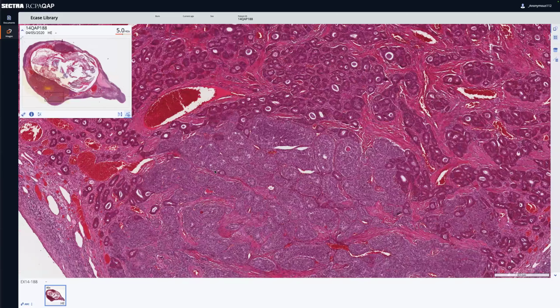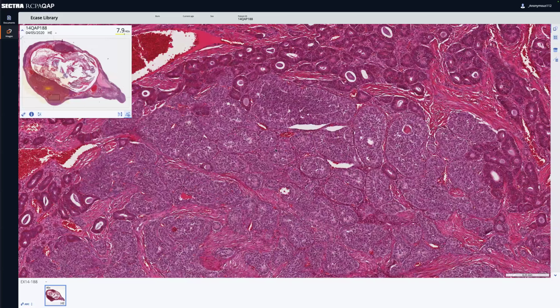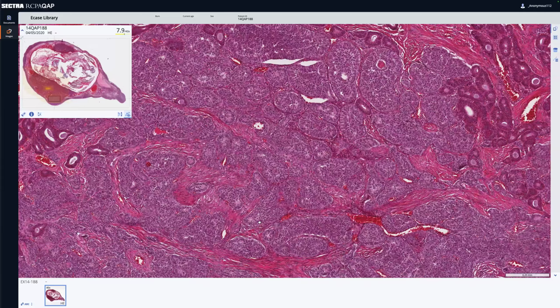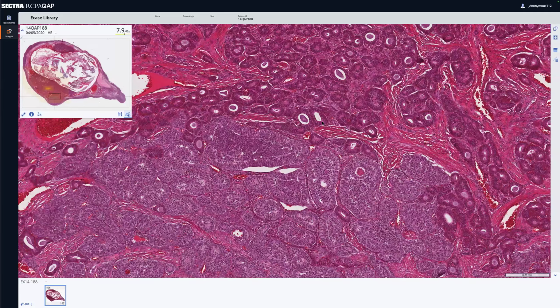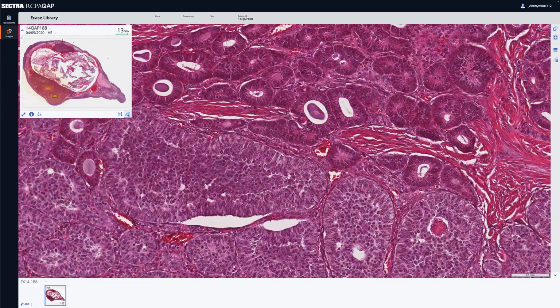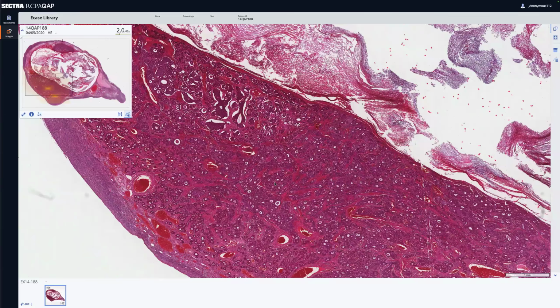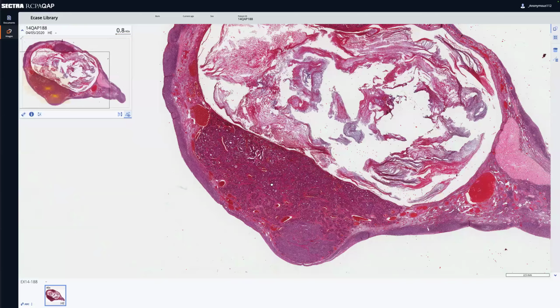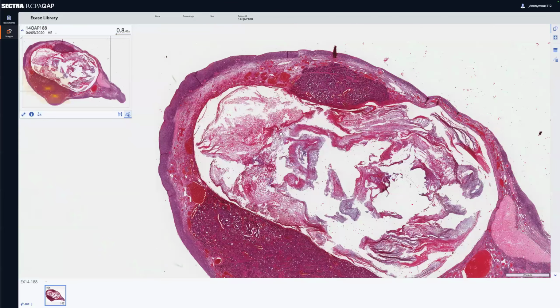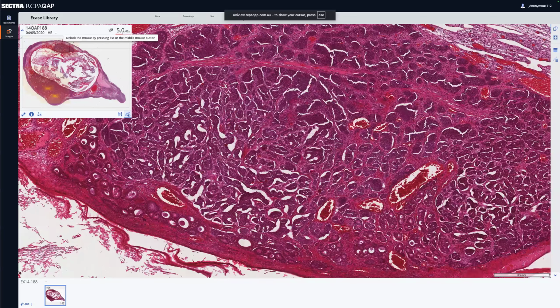We've got a couple of patterns here, where we've got this nice solid islet pattern. And I don't think this is thyroid. I think this is more carcinoid tumor. It's got the nice granules, even though it's got the pink stuff in the lumen there. So it's got an acinar, an islet pattern of carcinoid tumor. Every time I see thyroid tissue, which is often quite easy to spot, I go and look for the carcinoid tumor. So why am I calling this carcinoid tumor and not NET, neuroendocrine tumor?